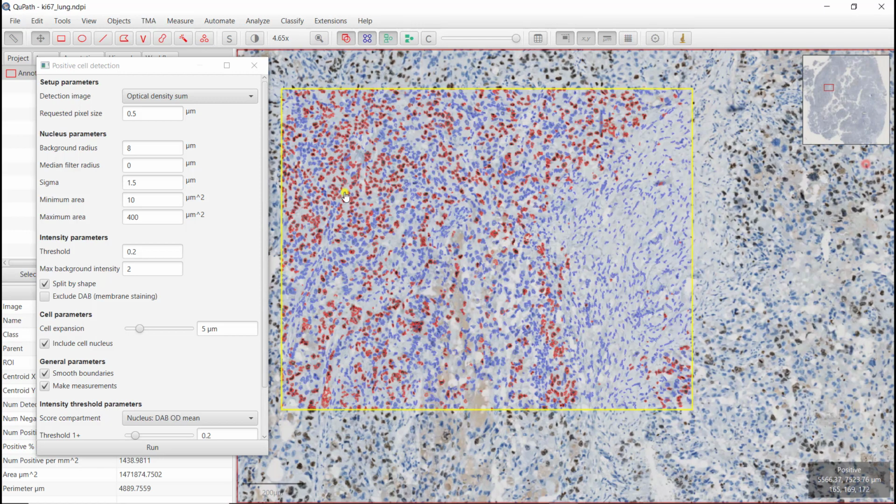But I'm not going to spend too much time here. Something that is important is that when you're working with your images, you also know better what they correspond to, especially for regions that are non-specific. Like in here, we see that we have some DAB in the background that can perturb the segmentation, and that's the kind of thing you need to look at. And probably when you work on your images, you're the best placed person to do that.